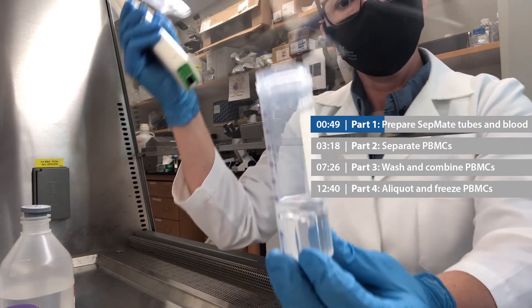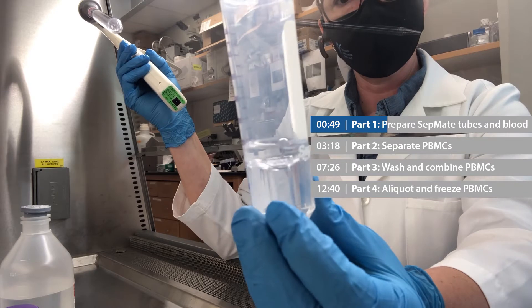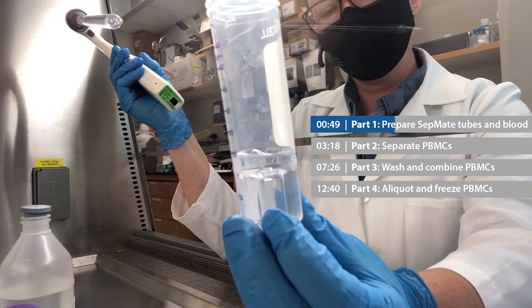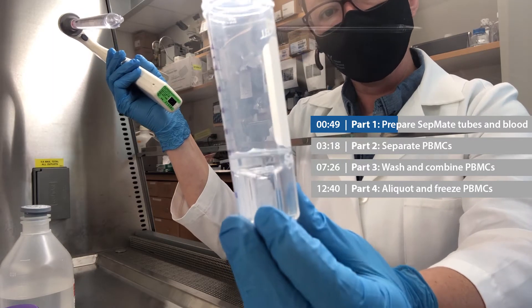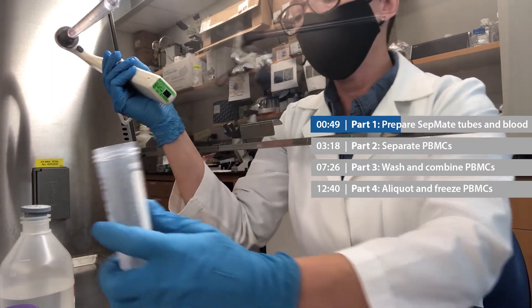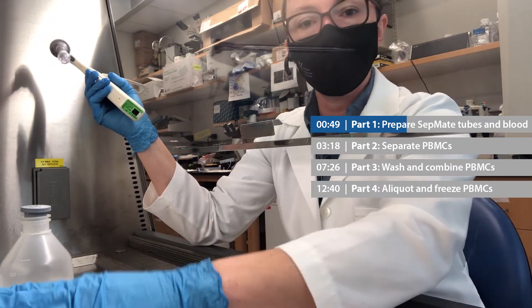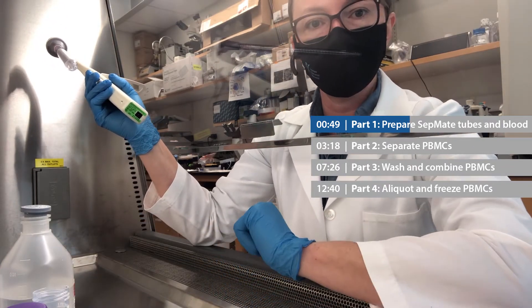There we go. As you hopefully can see, the surface of the liquid is actually just a little bit above the top of that plastic insert, and that's the way it should be. Now I'm going to repeat that process for my other three SepMate tubes, and then we'll move on to the next step.